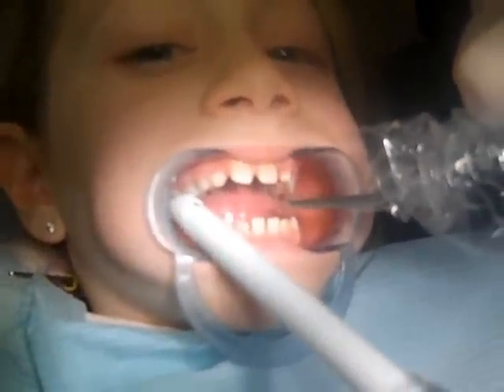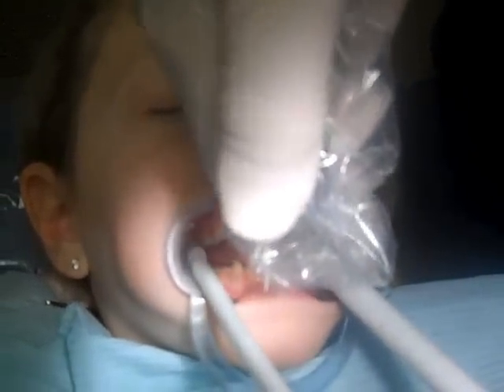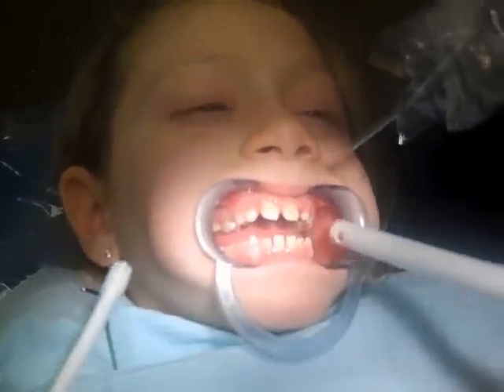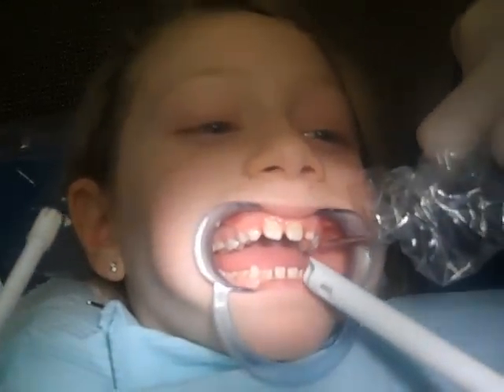What we're doing now is just finishing cleaning off the green jelly from Logan's teeth, and she is a champ. She is just doing unbelievably well here. Get it all nice and clean for us. You can see that Logan is still smiling — look at that big smile, so you can tell she's really enjoying this procedure.